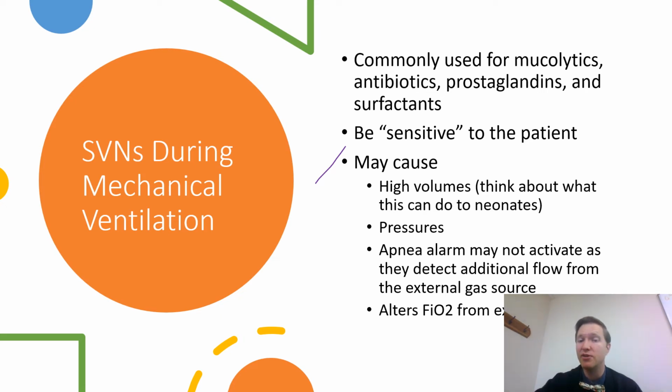But let's say you don't have that mode or don't know about it, right? Well, then you got to worry about the ability of the patient to trigger a breath. Because let's say there's a flow trigger set at 2 liters per minute, and you're adding 7 liters to that. So now they have to trigger a spontaneous breath, they have to pull in, instead of 2 liters, 9 liters per minute, right? That's a lot. That's a big ask for someone that's already in respiratory distress, right?